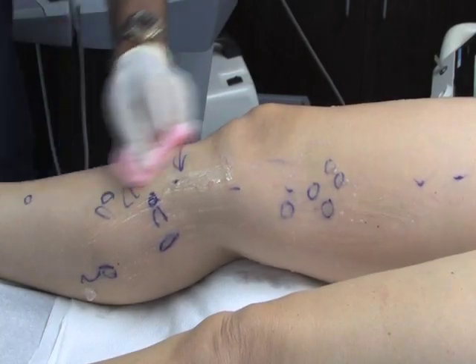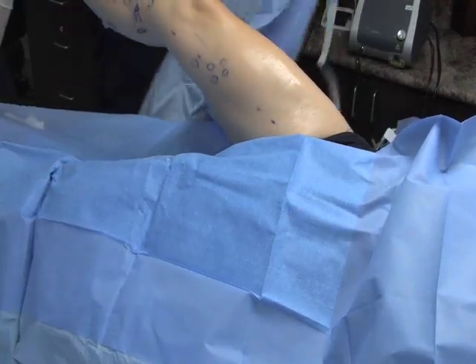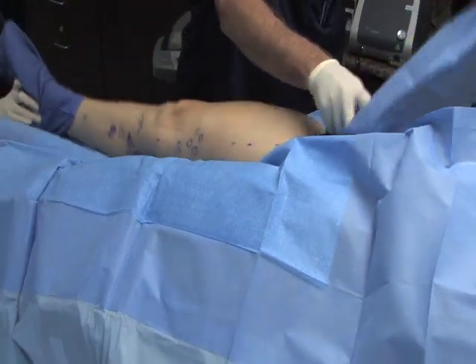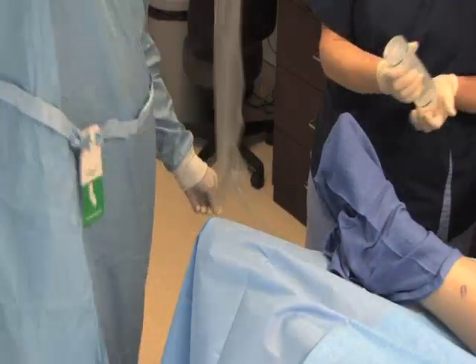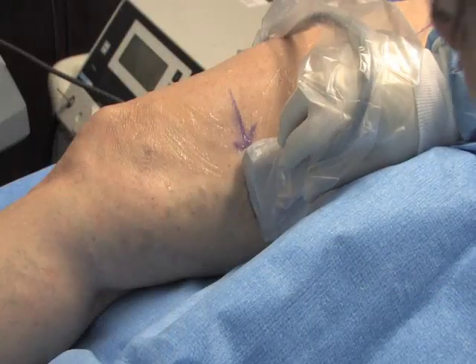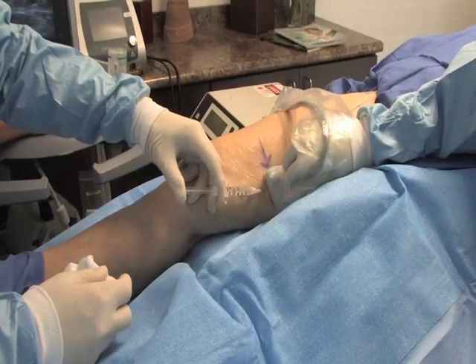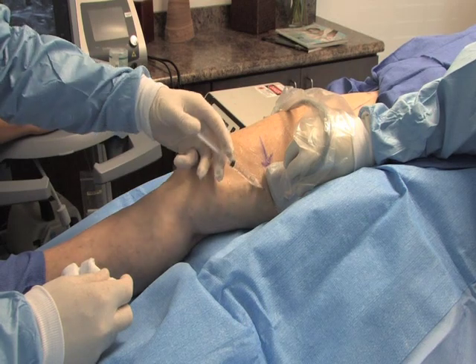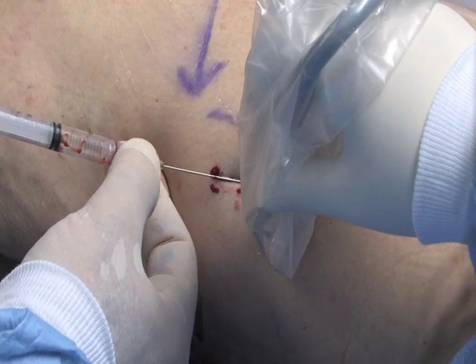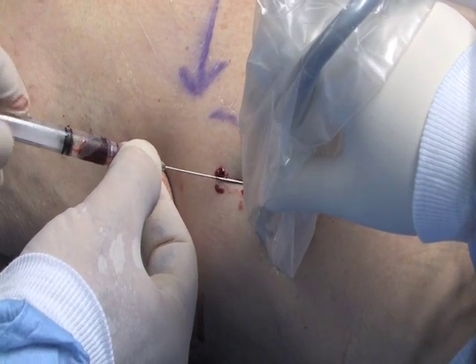Change the patient to the supine position. Prep and drape the patient along the medial aspect of the knee in a standard sterile fashion. Prepare the linear transducer in a sterile probe sheath and locate the greater saphenous vein in the region of the medial aspect of the knee. Inject a skin wheal of 1% lidocaine without epinephrine at the planned insertion site. Using real-time ultrasound guidance, cannulate the greater saphenous vein with the introducer needle.